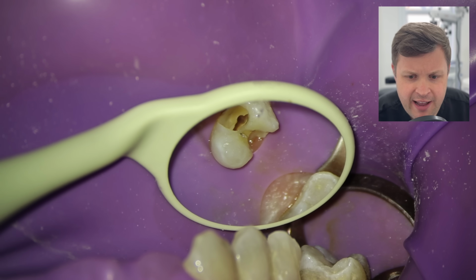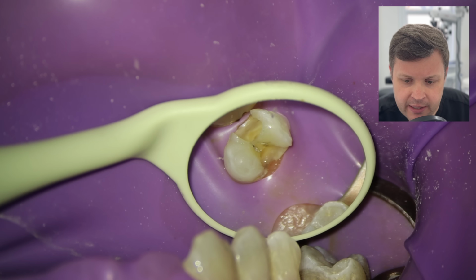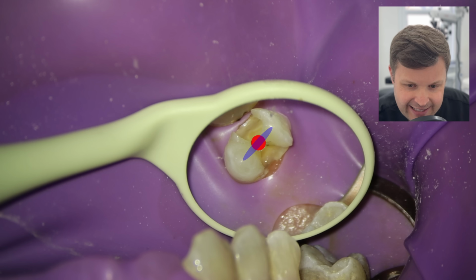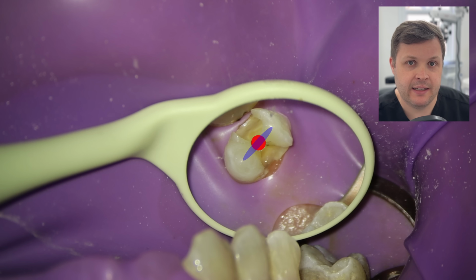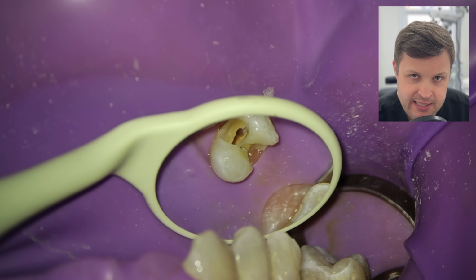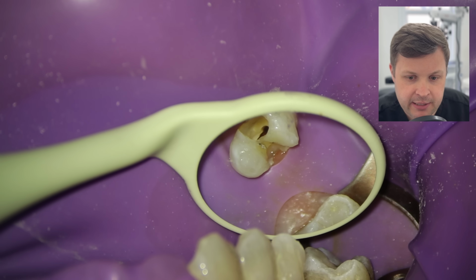So we look at the canal here, and it's kind of ribbon shaped. If we annotate on the video here, the ribbon shape is this kind of blue colour, but the shaping of the rotary file is actually straight down the middle of the tooth. So according to the rules of Krasner and Rankow, the canal is in the center at the CEJ, and that makes me happy that this is a single rooted tooth. However, I feel like to obturate these teeth, especially with this dentin bridge, it's probably going to be a little bit difficult.